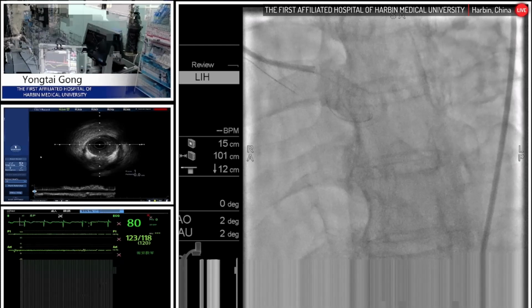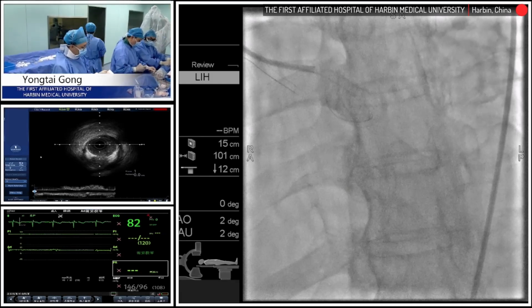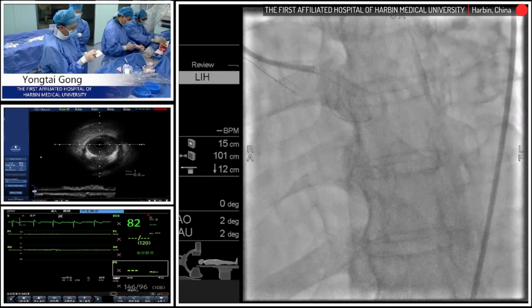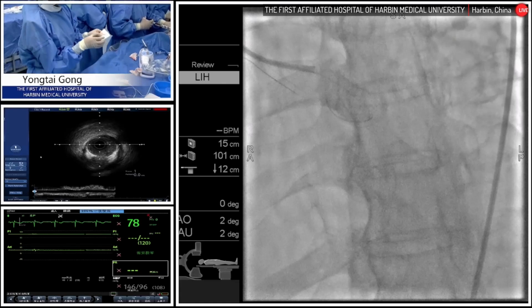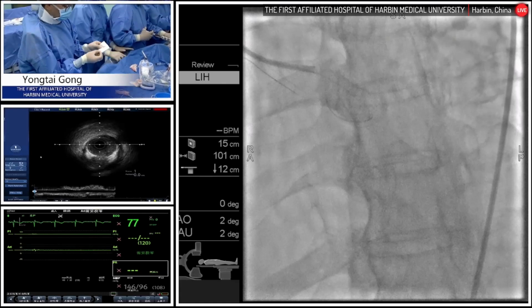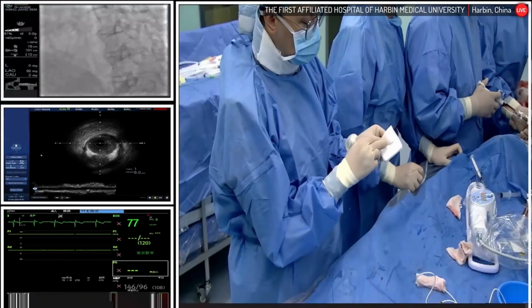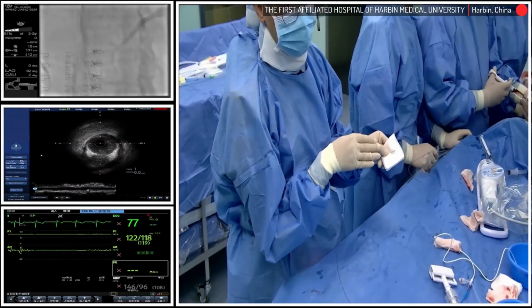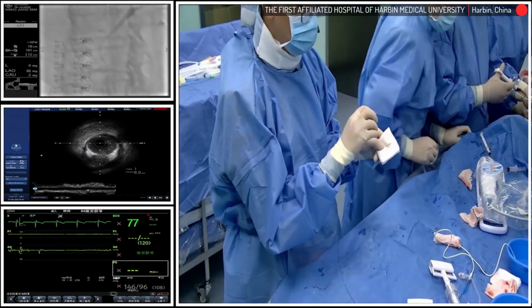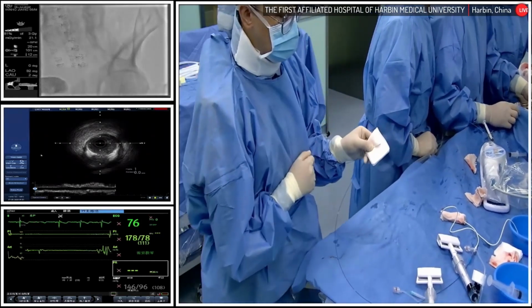So you can see the microcatheter is so tiny, so we do not worry too much that the catheter is occupying the space and blocking the blood pressure from the proximal part, which means that this kind of device is superior to the wire-based FFR, since it doesn't influence the accuracy and the final result of this measurement.